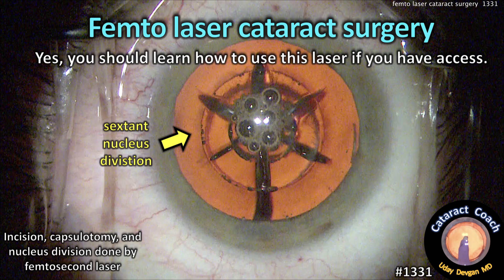CataractCoach.com — femtosecond laser cataract surgery. Yes, you should learn how to use this laser if you have access.